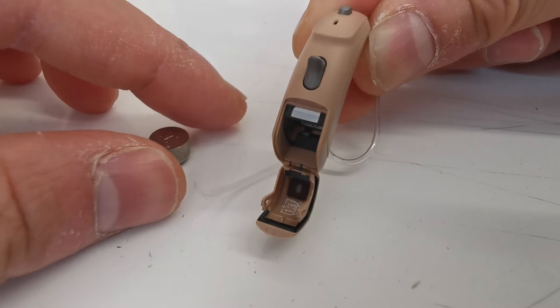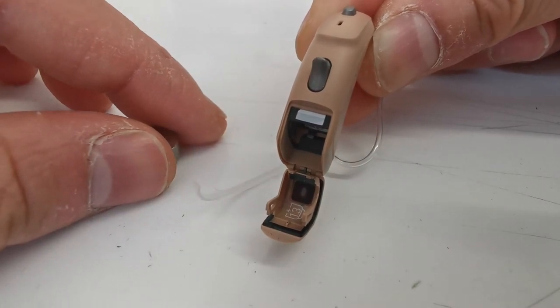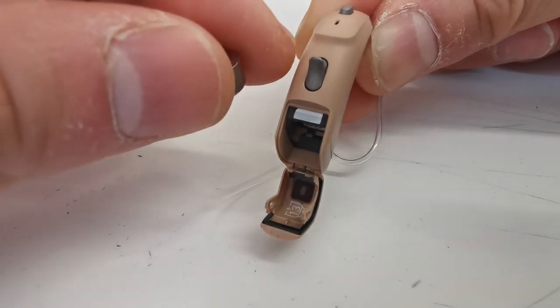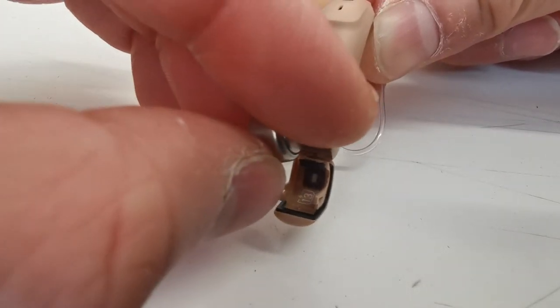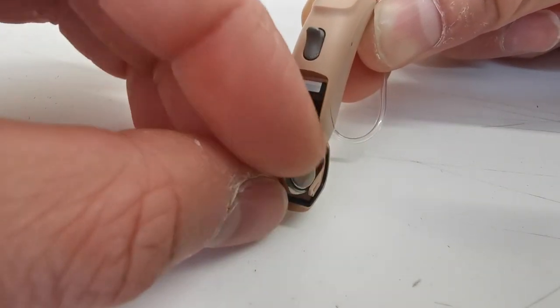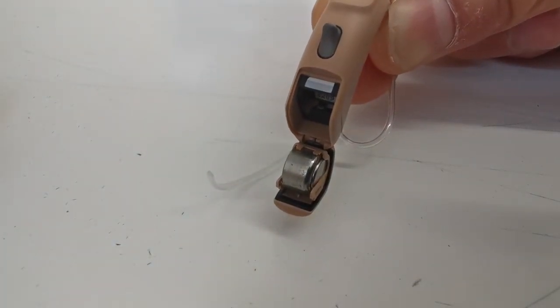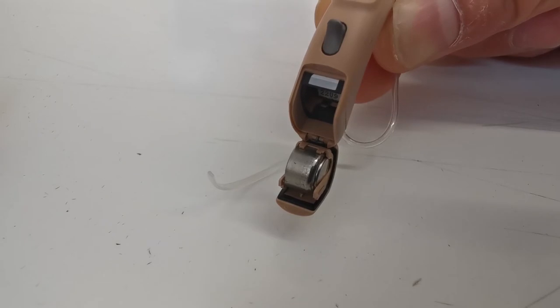It is important when you have the hearing aid held in front of you in this orientation to put the battery in with the flat side to the left, like so. You'll see it slides in easily.